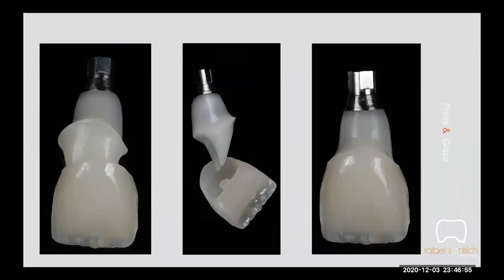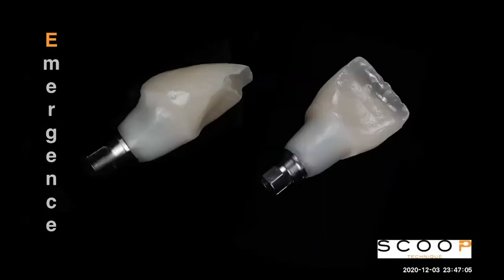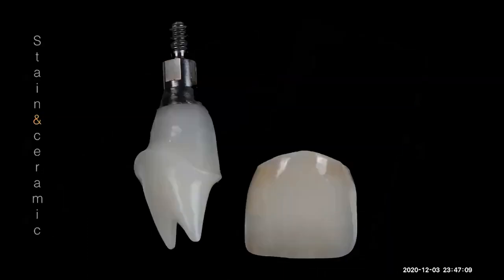We can see the buccal characteristics, guys, the crack lines, all the effects that we need to match the tooth, because the tooth is really, really hard. We can see the emergence profile too. And we can see here all the crown is already done.